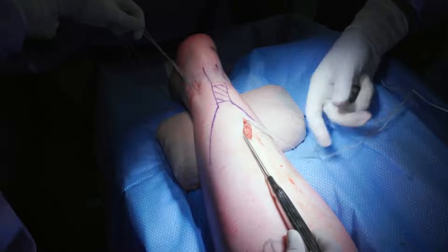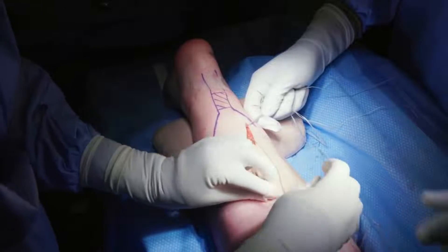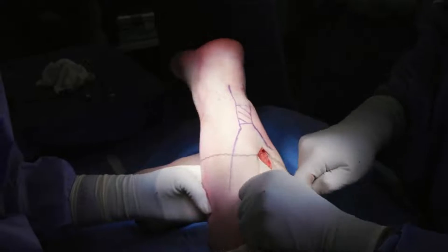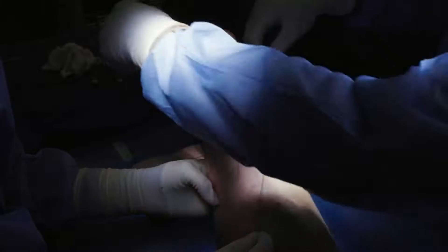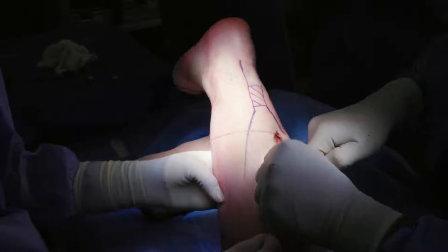Once all suture threads have been passed through the horizontal span of the Achilles tendon, each curette instrument is removed one at a time, pulling the ends of the suture threads through the incision. After organizing the threads externally from distal to proximal, each suture is independently assessed by pulling on the suture ends to produce a plantar flexion response. Both suture positioning within the tendon and overall tendon grasp can be discerned at this stage, with prior steps repeated until satisfactory results are achieved.